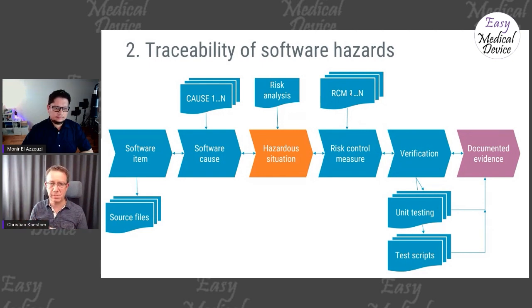A good thing with having tools to support you is that tools force you to have a similar language all the time. Perhaps you have seen in your risk management work that things are phrased slightly differently, but the intention is that it should be the same. And then when you review it, you still get questioned about whether it is the same or not.